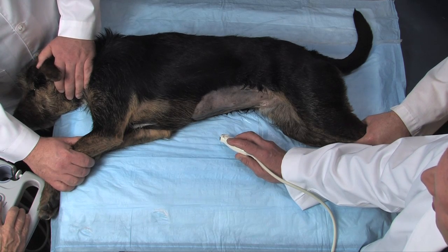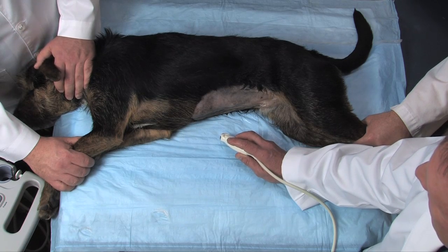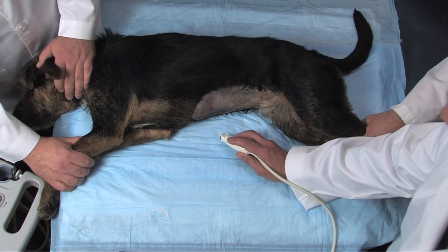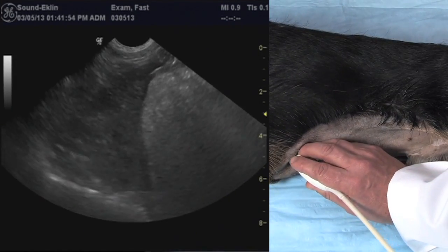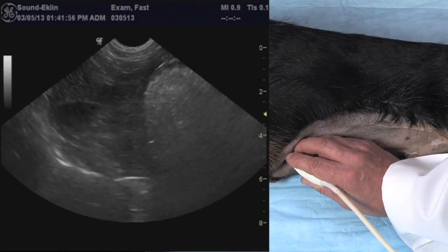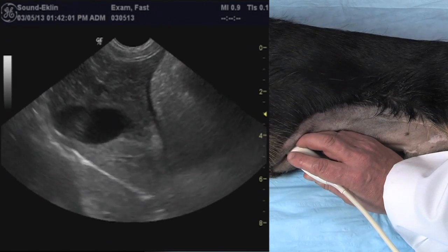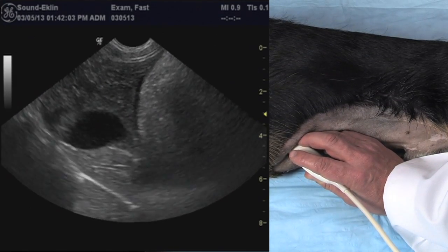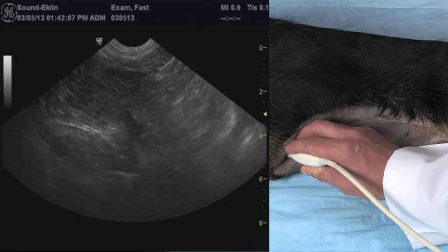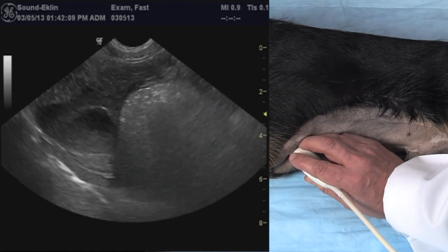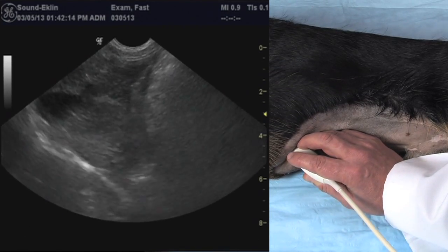Notice this dog is shaved just to better show you landmarks; however in most cases shaving is unnecessary for adequate imaging during AFAST exams. To start with the DH view, the probe is placed at the sub-xiphoid area, where the gallbladder kissing the diaphragm is imaged as shown here. Once that landmark is achieved sonographically, we fan through liver lobes towards the table top and away from the table top looking for free fluid. This dog is negative.